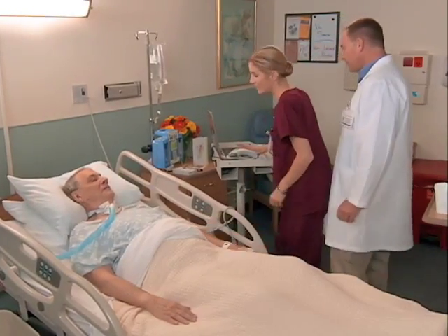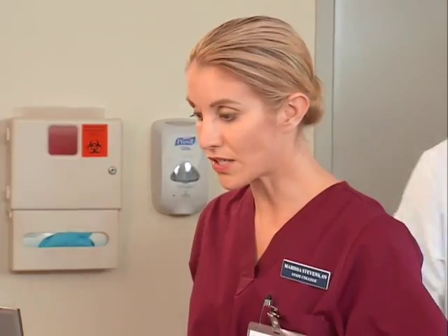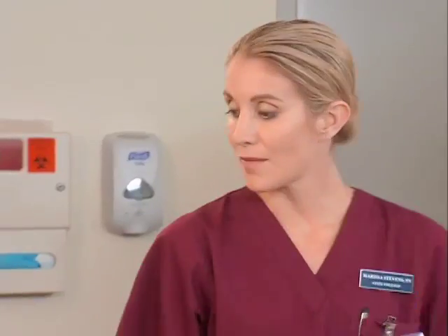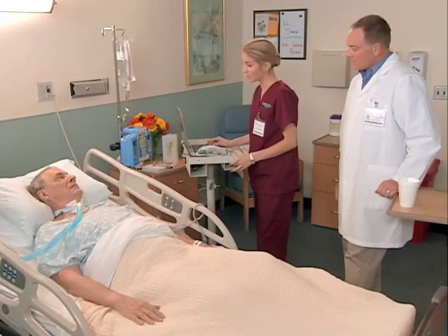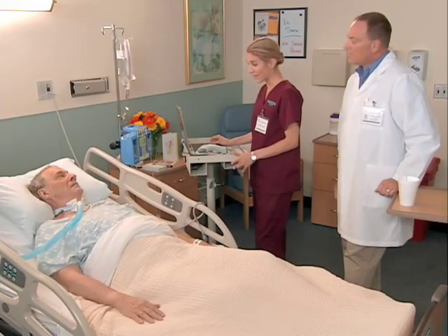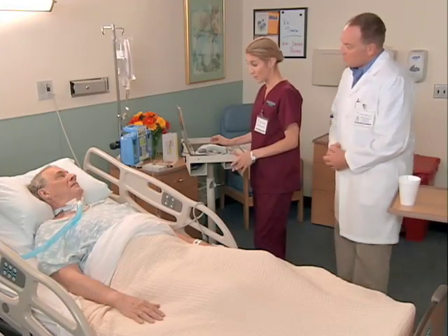Great, thank you. Now before I get started, are you in any pain? If you were in any pain, I would address this first. Right. I'm going to start by changing the inside part of the tracheostomy, then the dressing on your neck, and the collar that holds it in place, okay? Now I'll make sure to announce each of my actions aloud so you know what I'm doing. If at any time you have pain or feel bad in any way, signal me and I'll stop right away.